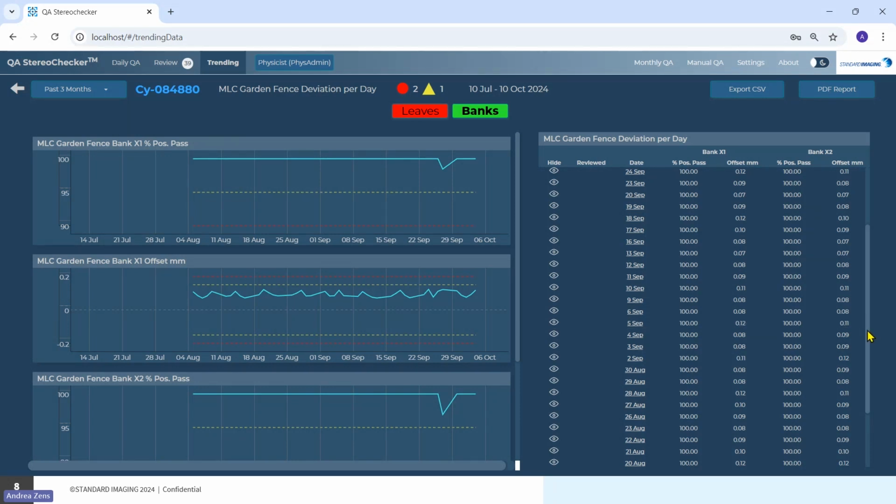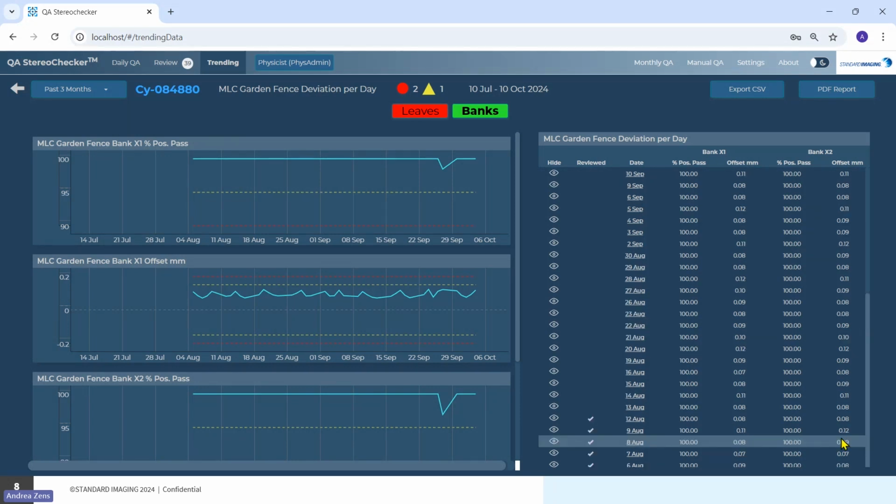The other thing is, because in that one click, when you've started your test, the system as a whole is going to be querying that data. It's going to be analyzing that data, and we save it and we trend it all in that one go. It means it gets saved and trended before possible review. So there, we just give you the indication whether something has been officially reviewed or not in that column.